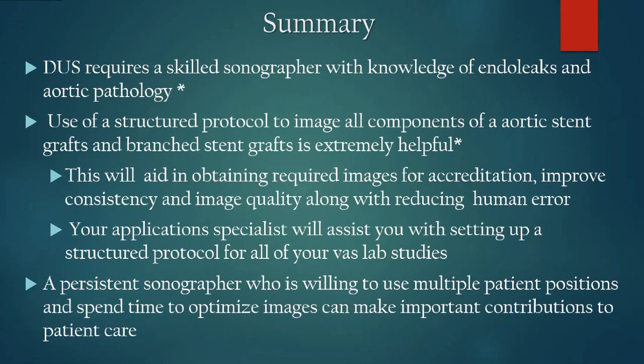Duplex ultrasound requires a skilled sonographer with knowledge of endoleaks and aortic pathology. The more studies you do, you're going to continue to improve your skills. So if you have the opportunity to scan these patients or even back scan after somebody else, you're going to improve your skills, and it's rewarding doing these patients. It's fun.